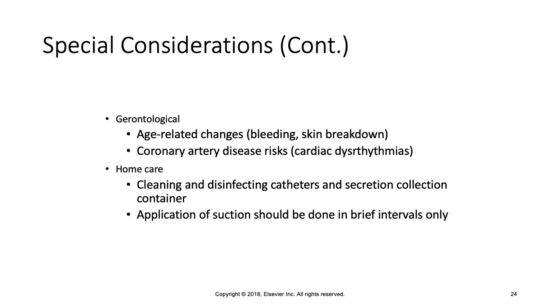Stop if the pulse ox O2 sats go down to less than 90, or if the blood pressure or pulse rate increases or decreases 20 or more beats per minute. All things that you want to teach them. And no more than a maximum of 3 suction passes at a time.